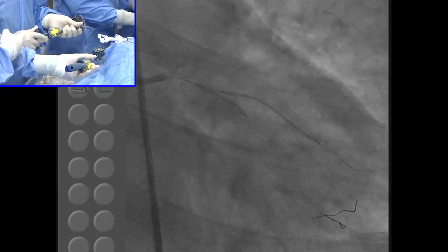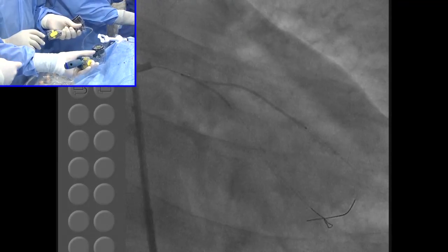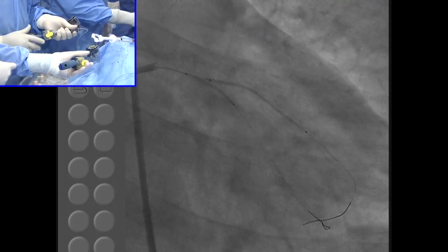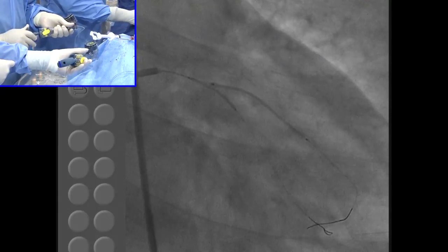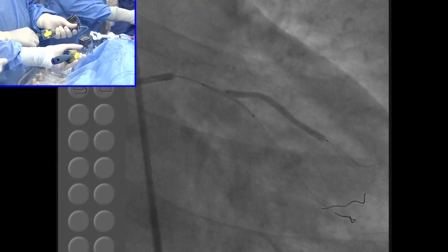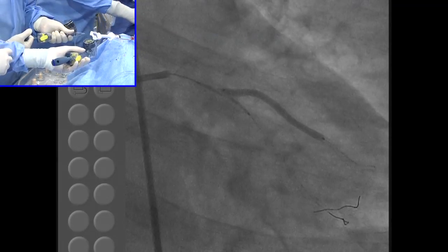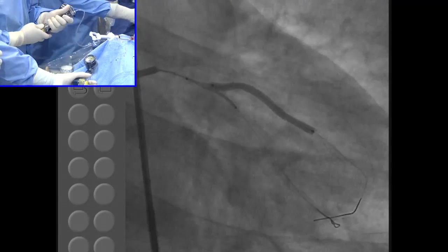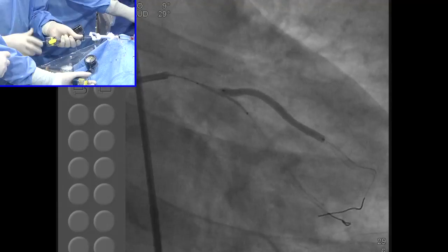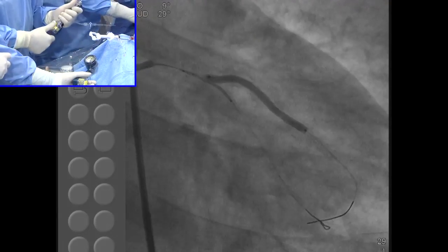Yep. So the side branch, which is 2.5/38, will be inflated first. So Anu, is this the first time in life Samin Sharma became a side? Yeah. All right. Okay. 16. Okay, down. Go up again. Now I need a new filler, okay?